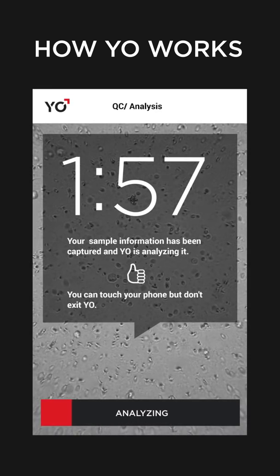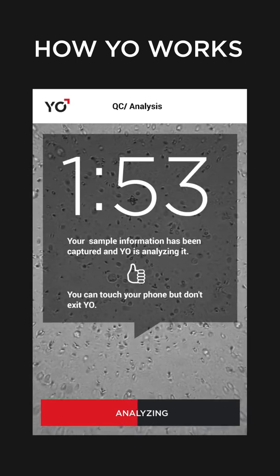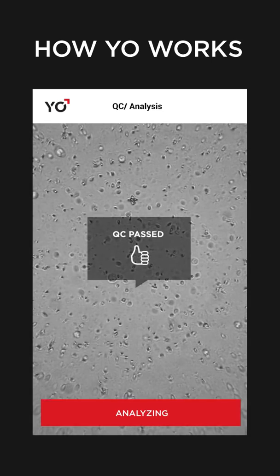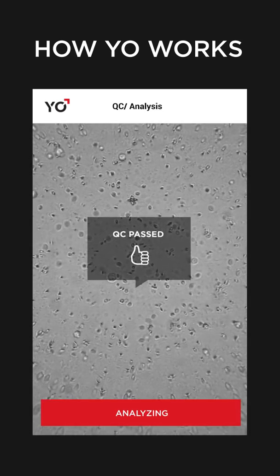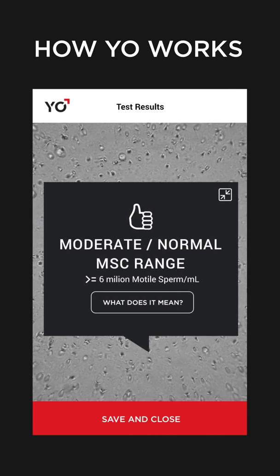Next, YO will analyze the captured video of your sperm. First, YO makes a quick QC check to see if everything is good to go. Your test results and video are shown in about 2 minutes.